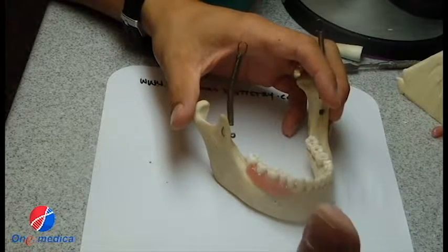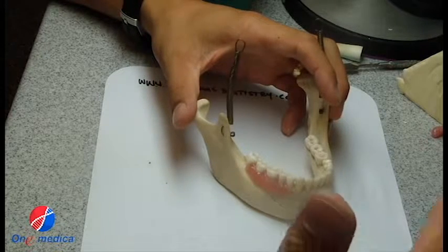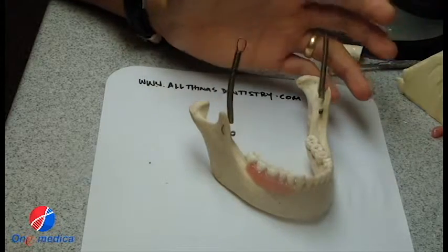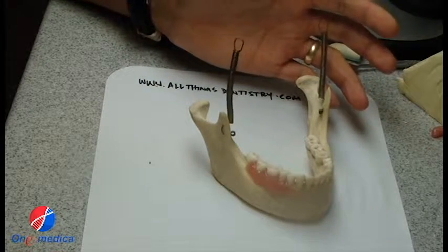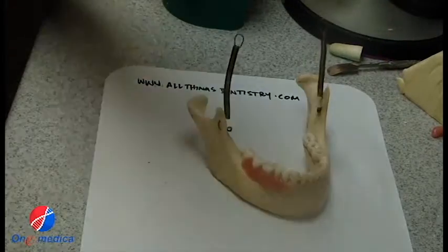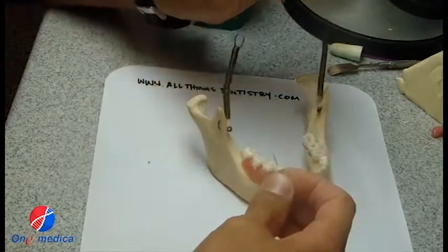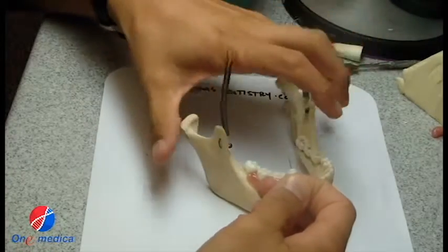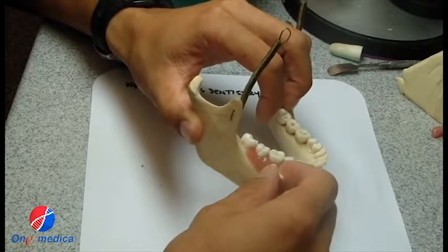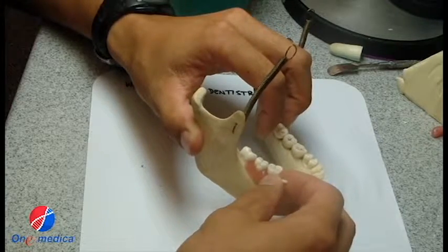I wanted to talk briefly about intraosseous anesthesia techniques. Now, there are a couple products out there that I'm aware of. One is Stabident, and the other one is X-Tip. Stabident is just a product that has a perforator, essentially a trephine that you place into the gingival tissue posterior to the tooth that you want to anesthetize.